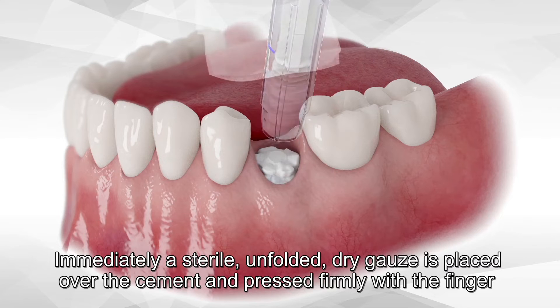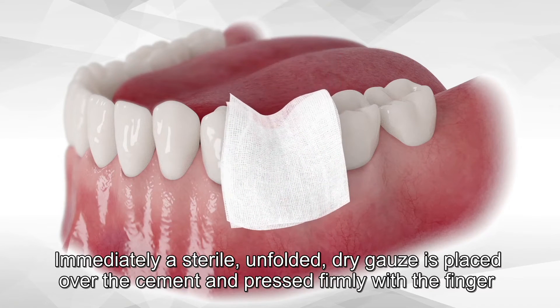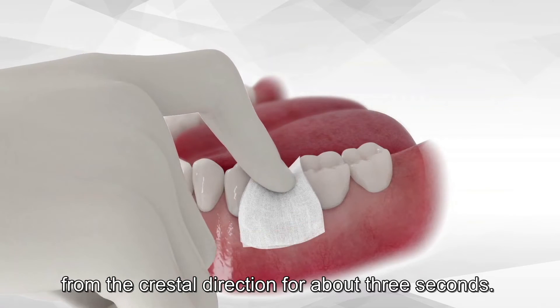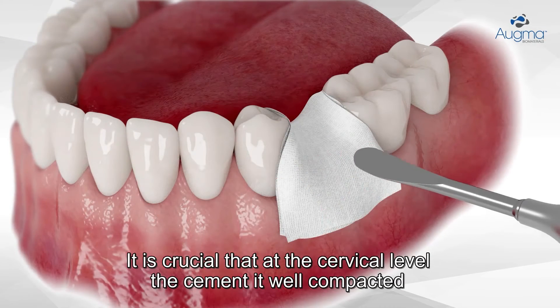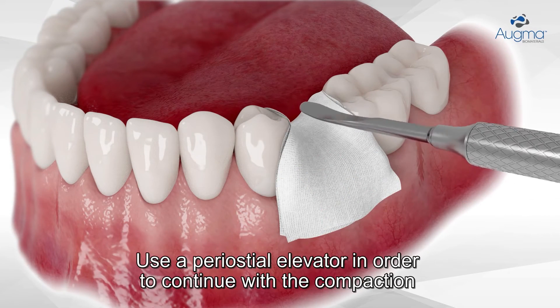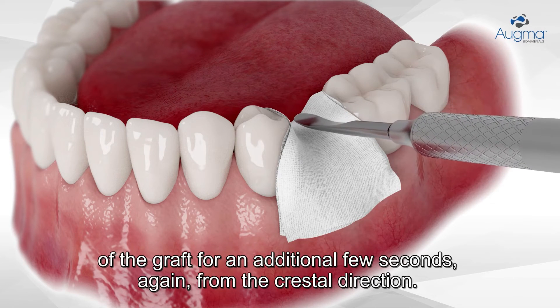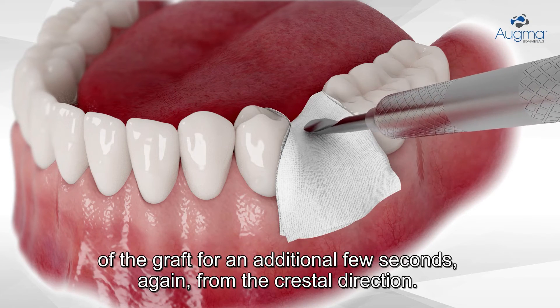Immediately, a sterile unfolded dry gauze is placed over the cement and pressed firmly with the finger from the crestal direction for about three seconds. It is crucial that at the cervical level the cement is well compacted. Use a periosteal elevator to continue with the compaction of the graft for an additional few seconds, again from the crestal direction.